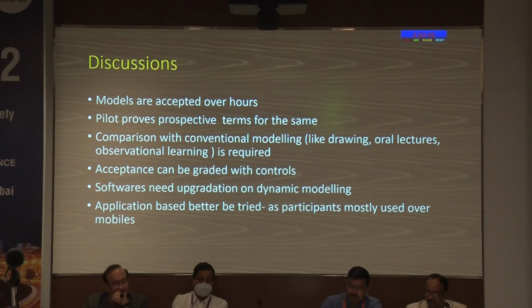The discussions would be that the models are accepted over hours, and the pilot proves prospective terms for the same. Comparison with conventional modeling like drawing, oral lectures, and observational learning is required, because just making a 3D model is already available, although it's a marketed model. But we want to have a free model. And then whether the acceptance of a free model is there or not, it's more of an SRM, social research method, but we need to find that out. We tried to find that out.